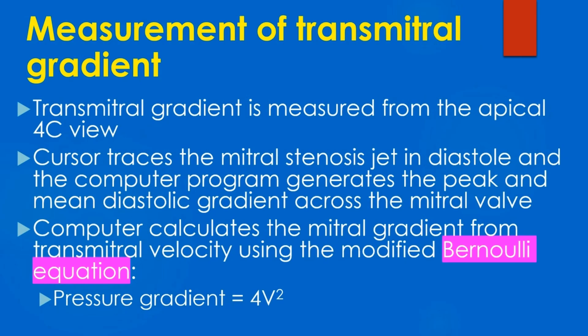Transmitral gradient is measured from the apical four-chamber view. The cursor traces the mitral stenosis jet in diastole and the computer program generates the peak and mean diastolic gradient across the mitral valve. The computer calculates the mitral gradient from the transmitral velocity using the modified Bernoulli equation, which states that the pressure gradient equals 4V squared, where V is the velocity.